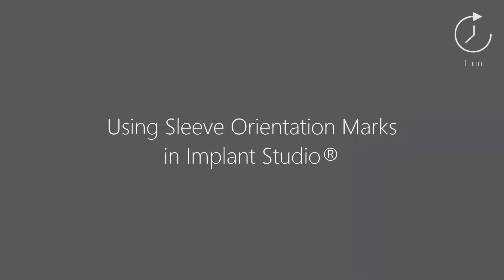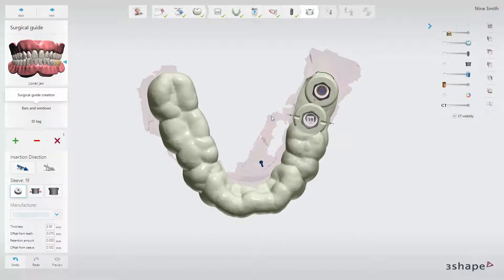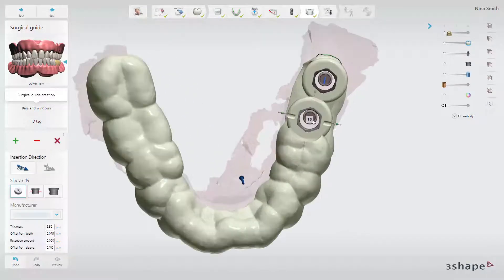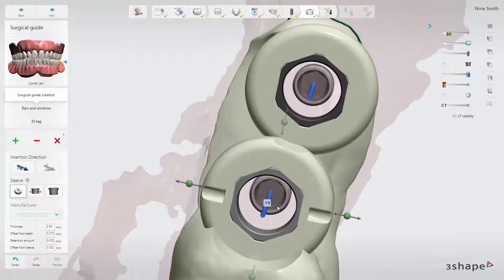In this video you will learn how to use sleeve orientation marks in 3Shape Implant Studio. Placing implants guided is generally recognized as a convenient, safe and effective alternative when the surgical procedure allows for guided surgery. It has great possibilities for full control of implant angulation and final implant depth.